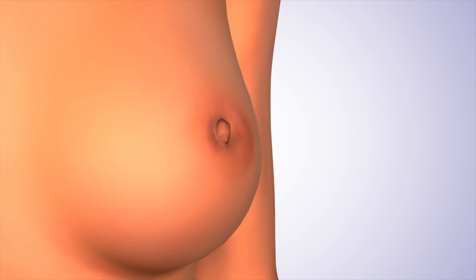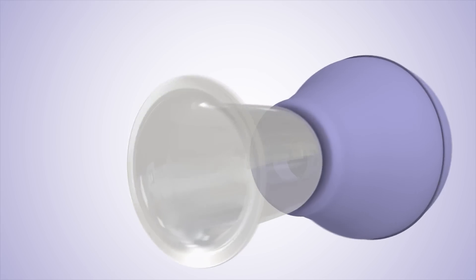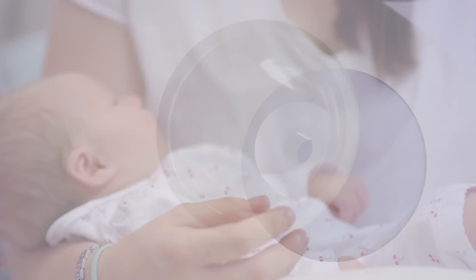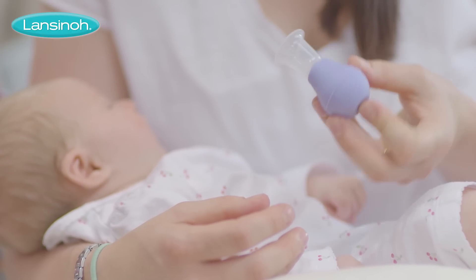The Latch Assist has been designed to allow you to gently draw out your nipple so your little one can latch on comfortably. It's easy to use with just one hand and puts you completely in control.